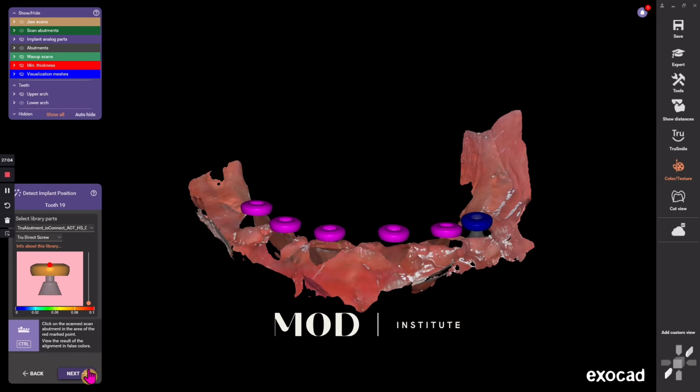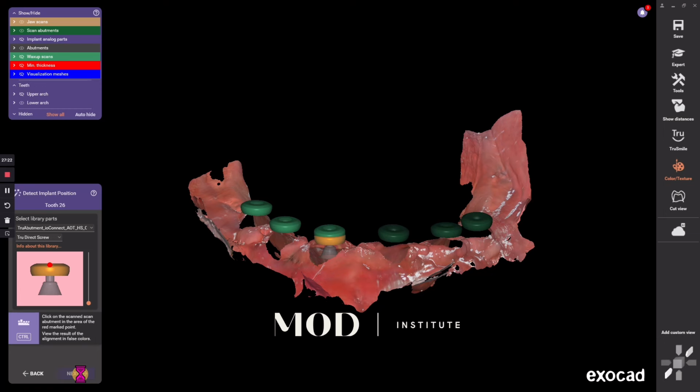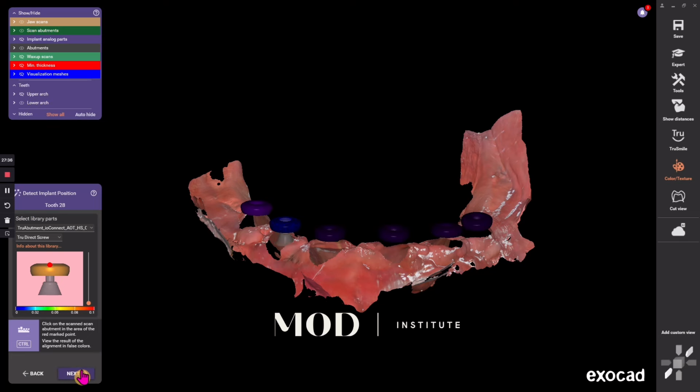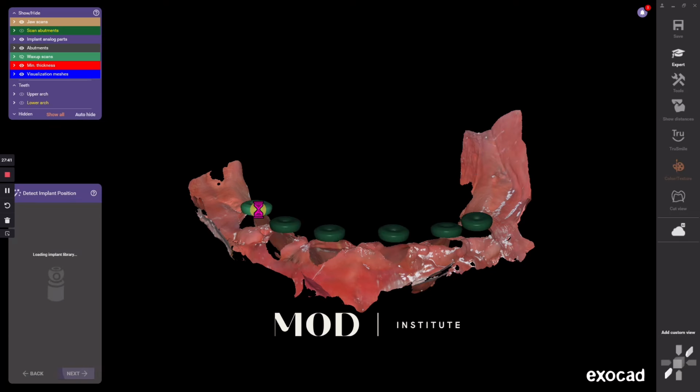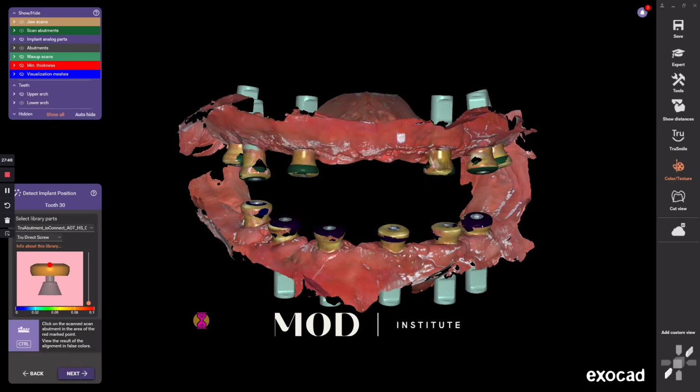So here we're going down on the lower and doing the same thing. And this process of designing the all-on-X prosthetic is super easy at this point. And there's about 6 or 7 different ways to do this. I'm using a kind of an older style way where I just have a wax up that's already been imported in that I did beforehand. And ExoCAD is just going to simply cut the locations of these implant MUAs. And here we're using TruAbutment's direct to MUA screw.